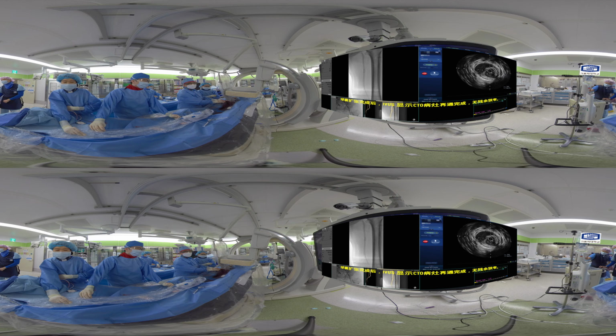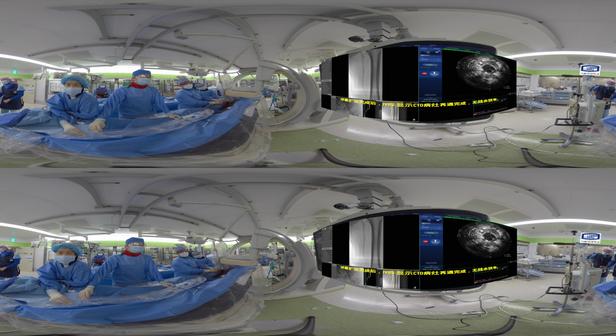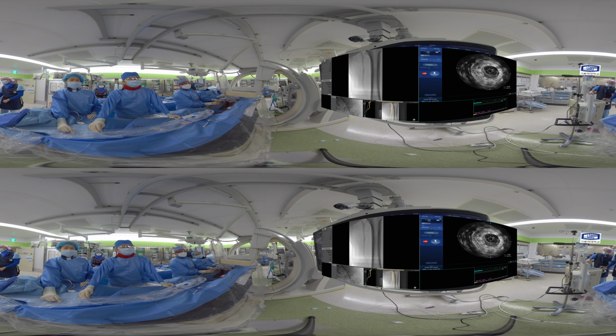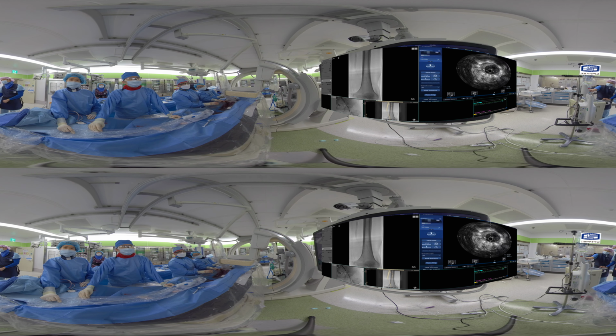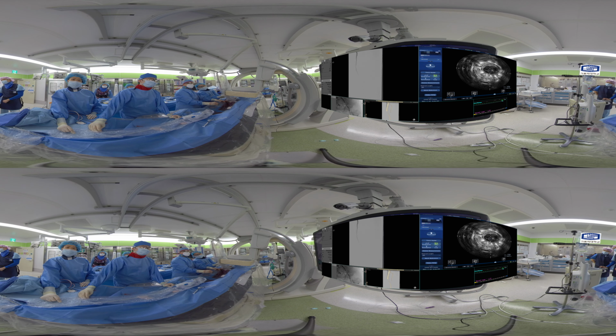After completion of PTA, IVUS showed the recanalized CTO lesion along the PTA site without residual stenotic lesion. The puncture site was closed by a Perclose device. Ankle brachial index after PTA increased from 0.3 to 0.75 in the left leg.